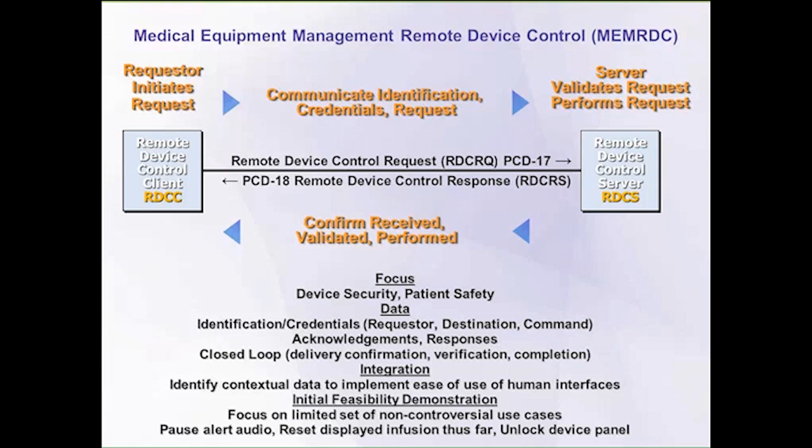And as I said, we do focus in the white paper on device security and patient safety. So you need to know who's doing something, why they're doing it, and log all that information.